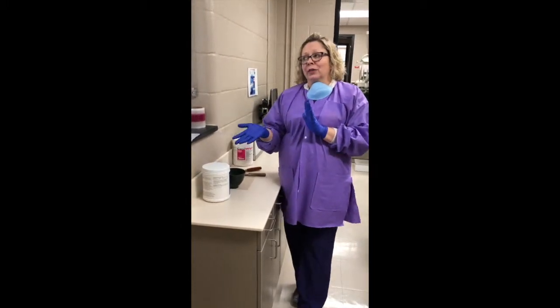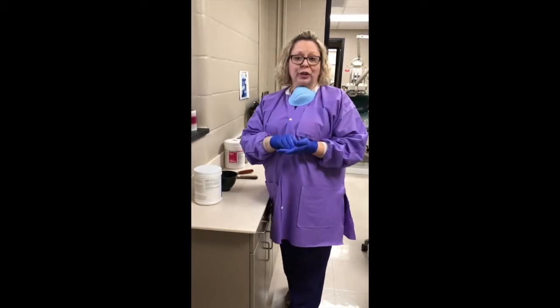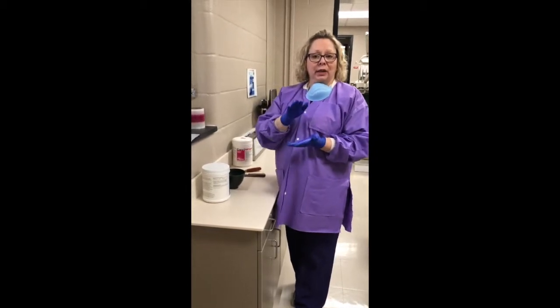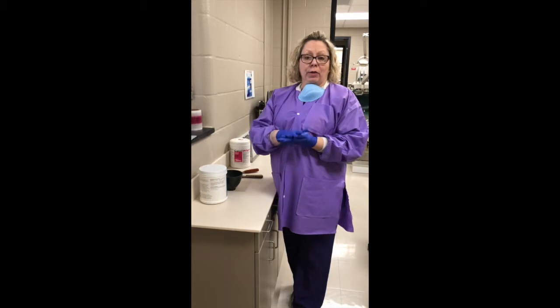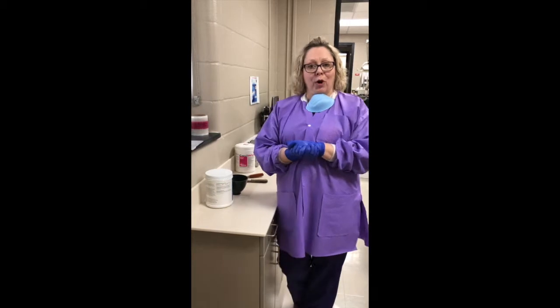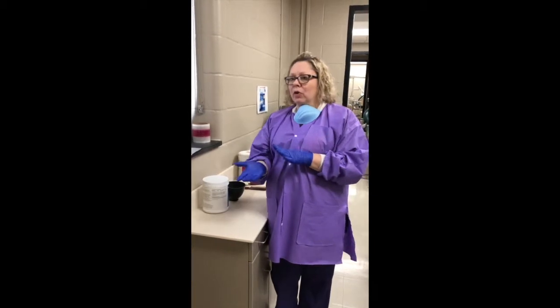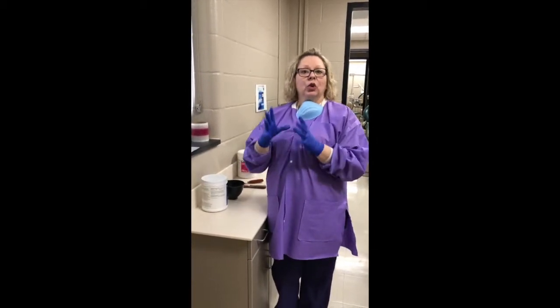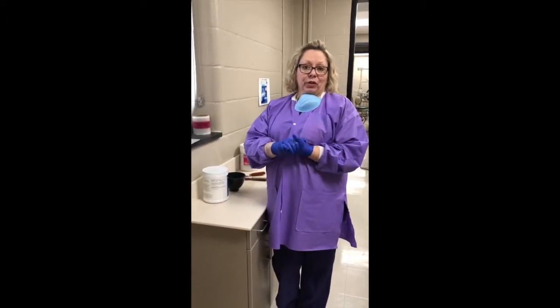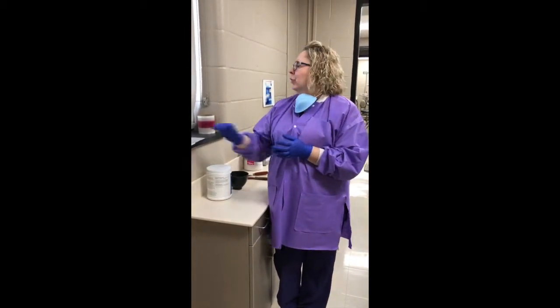Additionally, we use study models to create the actual partial denture. We take the impression, see where the missing teeth are, and that goes to the lab, and they use that to fabricate the metal framework or the acrylic framework of the partial or a full denture. We can also use an impression to pour up a model that we can then use to make either custom fit whitening trays or sports mouth guards, or for patients that have clenching or grinding issues while they sleep, we can create a custom night guard that will help protect their teeth from being damaged from the constant abrasion of occluding on them too heavily.